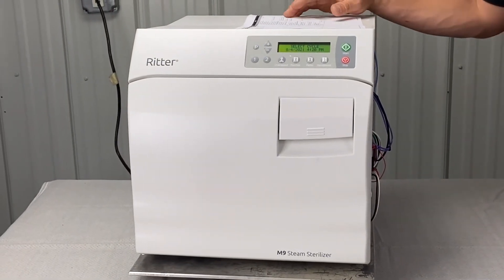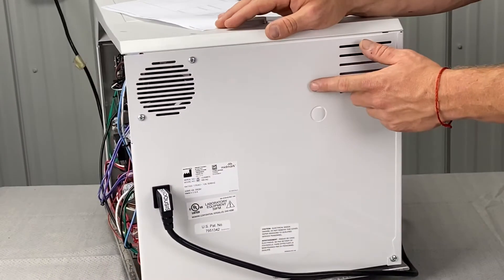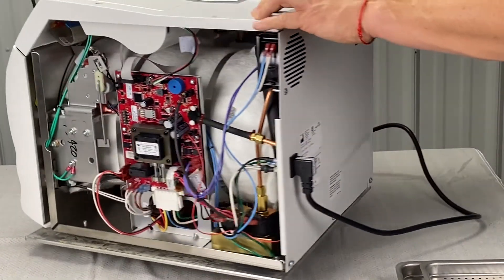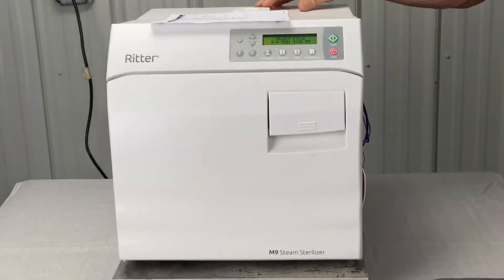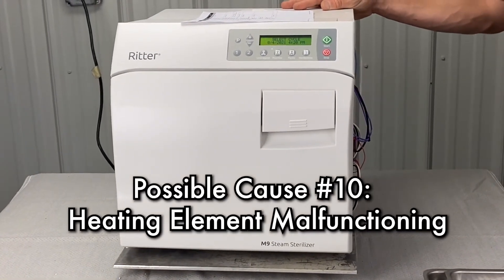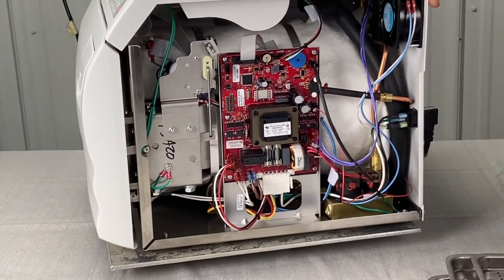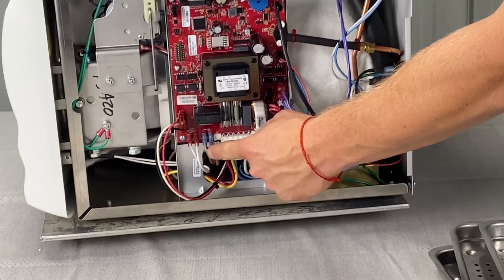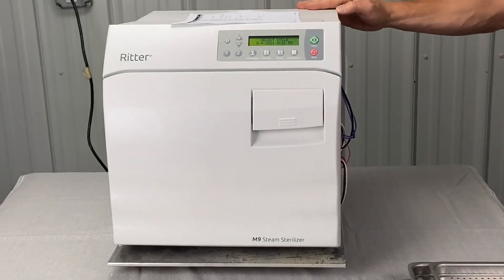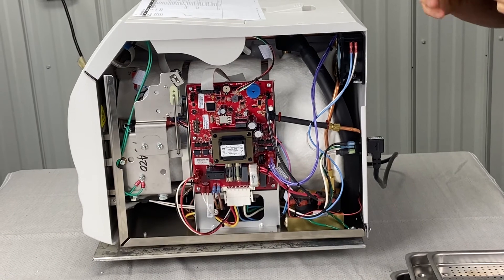If the unit completes fill mode but the error continues, there could be a defective air valve in the back — you'll need to take the cover off to look at it, but call us first. Sometimes the orifices go bad or stuff gets stuck in the plunger. Also check the pressure transducer tubing. The heating element may be defective — do a resistance test with a multimeter: unplug the unit, unplug the two brown wires, and read resistance; it should be either 9 or 11 ohms. It could also be a defective PC board or a heater relay not working — there are tests we can run for those.